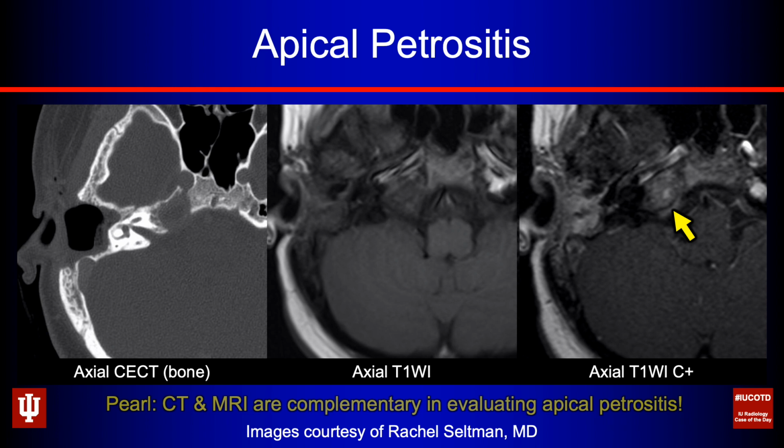So I say this for a couple of reasons. First of all, to drive home the point that hopefully I've belabored enough in this lecture, that CT and MRI are very much complementary when approaching these infections. But B, also to point out that you don't always get a true abscess forming. It's a spectrum of infection, okay? So don't wait until you have the abscess to call it. You need to get on the horn with their clinicians when you start seeing these features all lining up, because that's telling us that we have a process of infection that's forming. It's got aggressive features. It may not have completely loculated out as an abscess, and that's okay. They still need to know about it. These are all of these things that I'm talking about today. These are phone calls to the ordering docs.